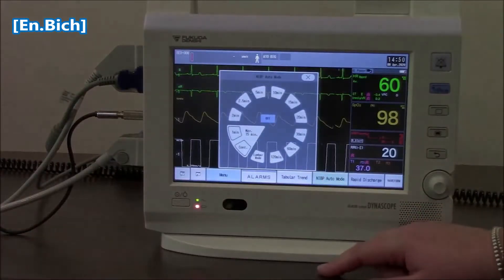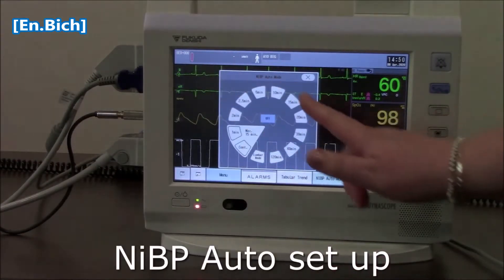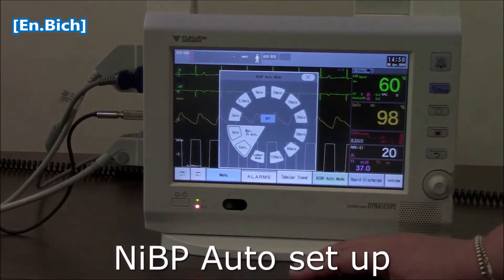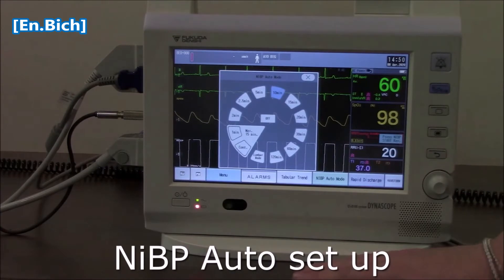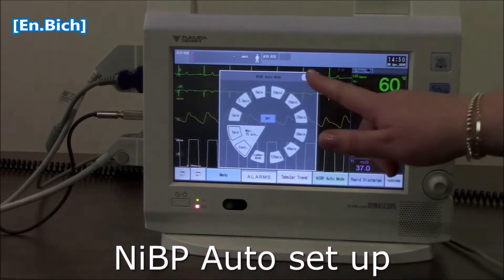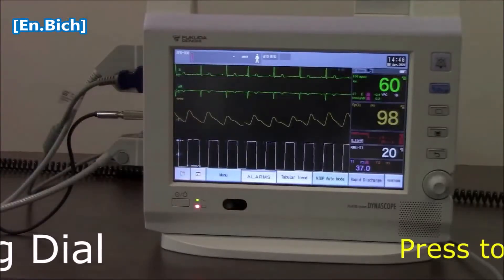I can also set my non-invasive blood pressure to go automatically. Anything from 2 minutes around to 2 hours is standard, and all I need to do is touch the time interval that I would like. Press the blue go button and it will go every 10 minutes as I've set there, until I turn it off again. And you can see how that works.